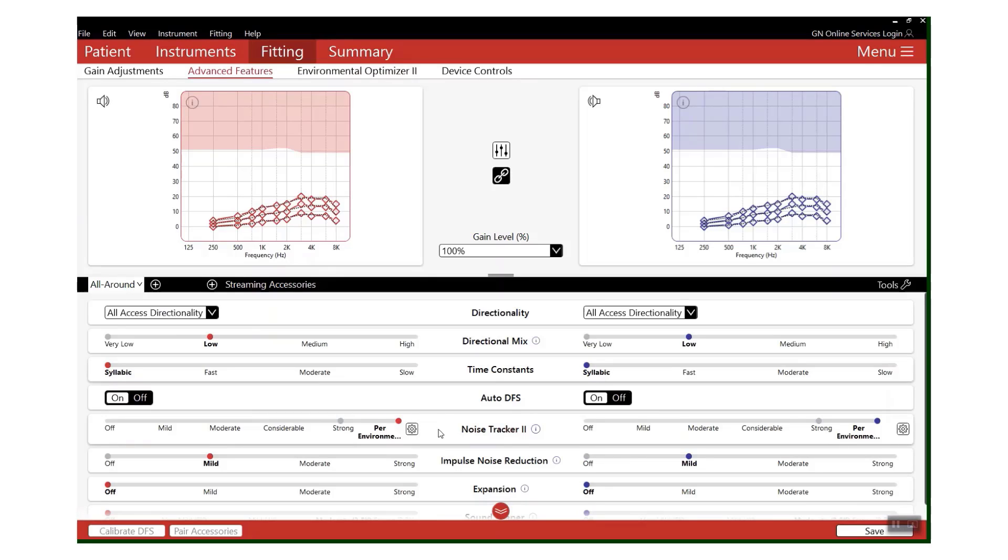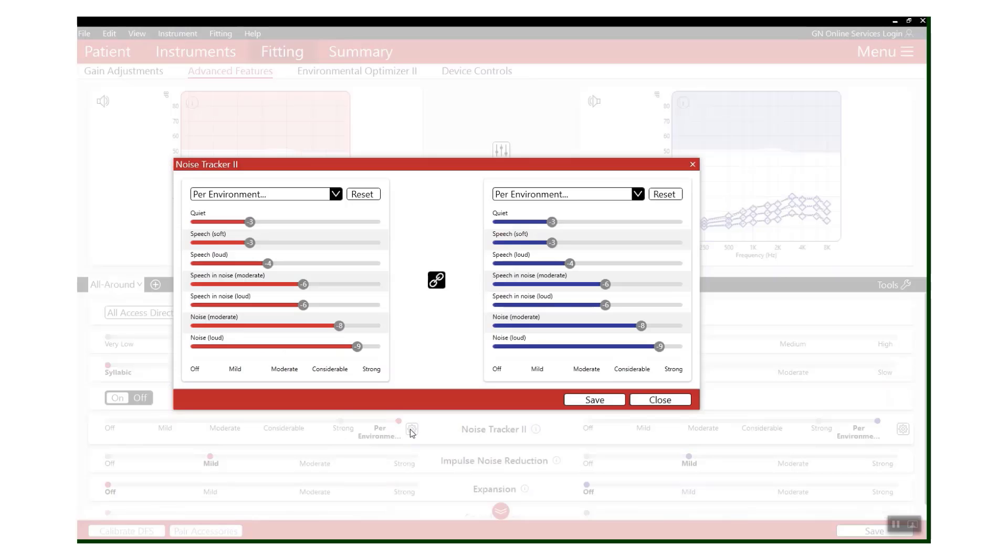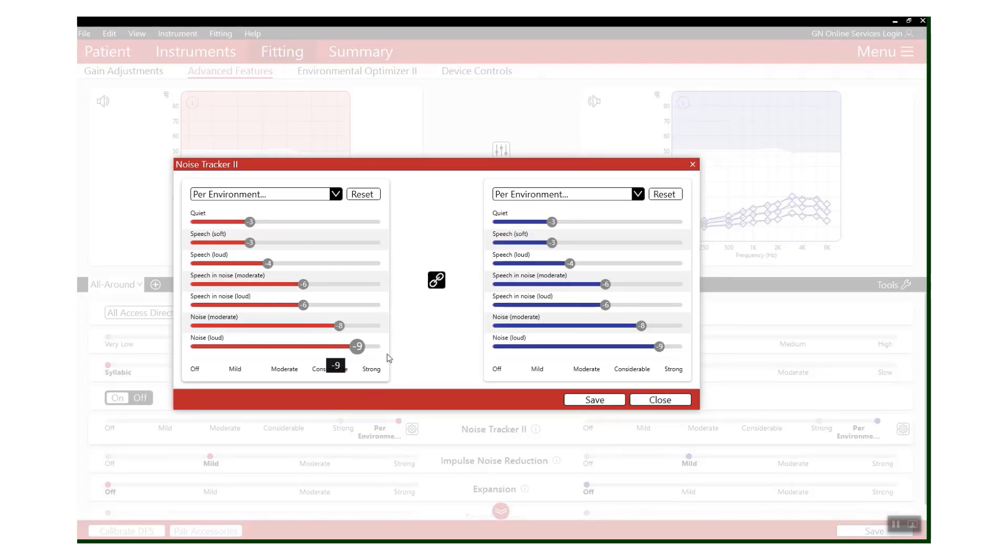Noise Tracker 2 is our noise reduction feature. This uses spectral subtraction to reduce that background noise while leaving the speech completely unaltered. Again, as we're talking about top level technology, you will find that there is a per-environment option. If you click on the little settings wheel, you'll see that the same seven environments that we just found in Environmental Optimizer 2 are available in the Noise Tracker 2 per-environment setting. It's almost as if we thought about it.